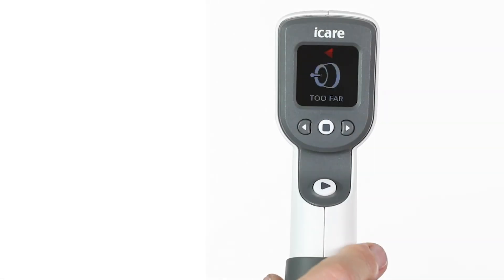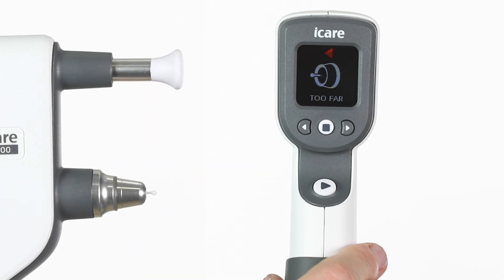Error Messages. If there is an error when taking a measurement, the tonometer will beep twice, display the error message, and the probe base will flash red.